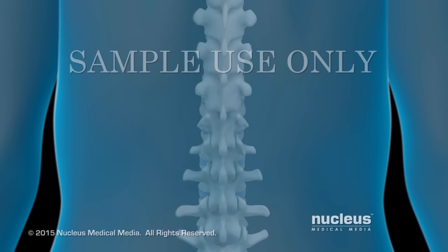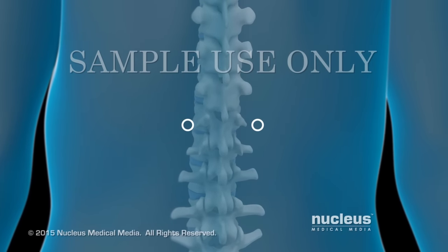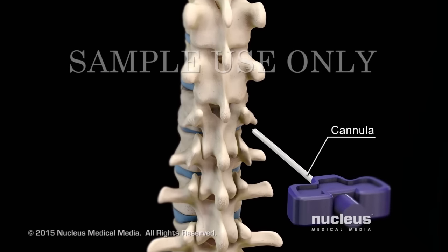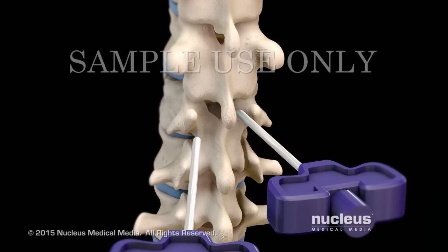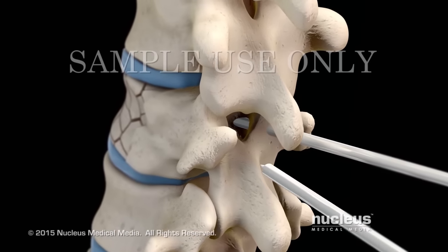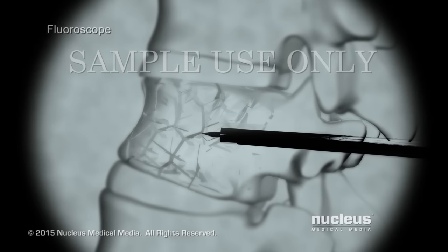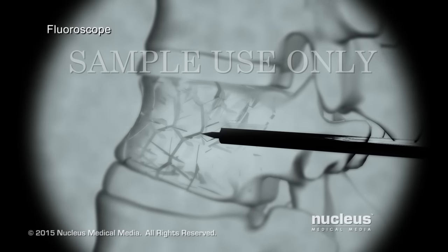Your doctor will make two small puncture incisions on your back over your fractured vertebra. A hollow tube called a cannula, along with a pointed instrument inside it called a trocar, will be inserted through each incision into your fractured vertebral body. Your doctor will use a real-time x-ray machine called a fluoroscope to guide placement of the cannula and trocar.